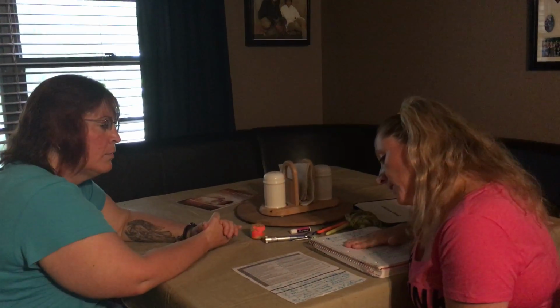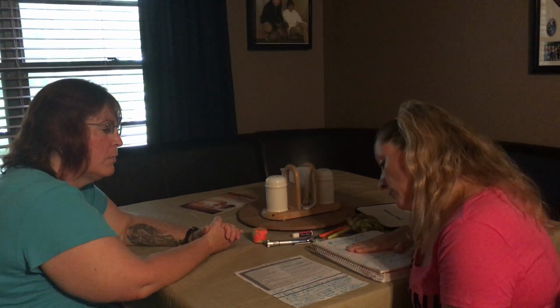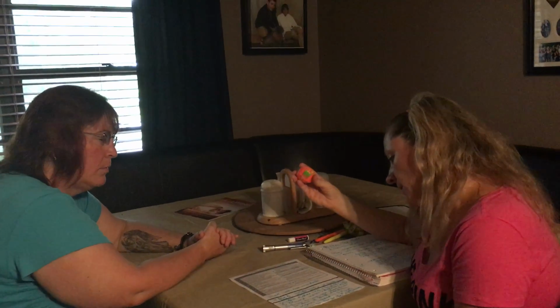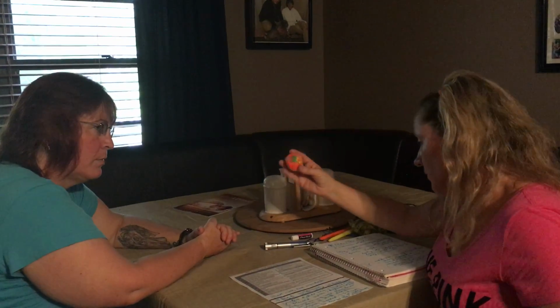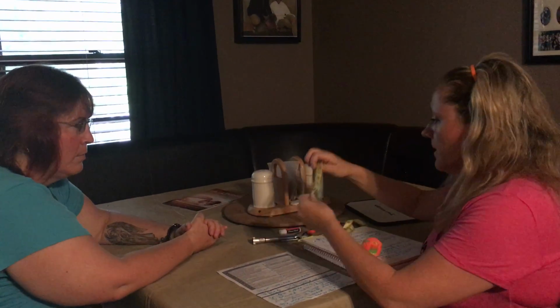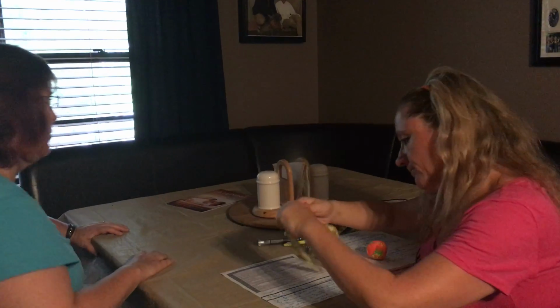So the next one, what we're gonna do is, I'm gonna actually pick this one. You're gonna focus on this object, which is gonna be 2 feet away from you, so I'm gonna measure that. And then the other one is gonna be 12 inches.